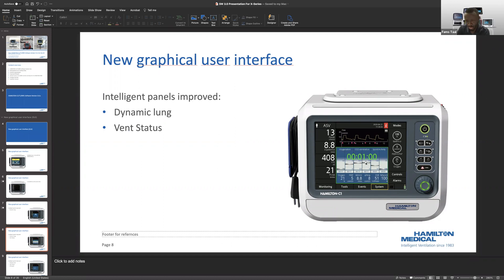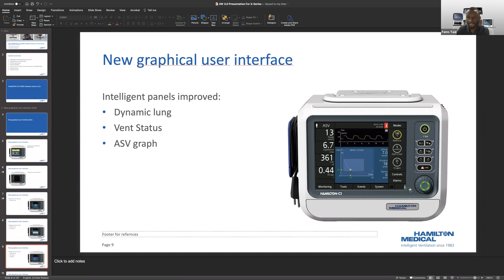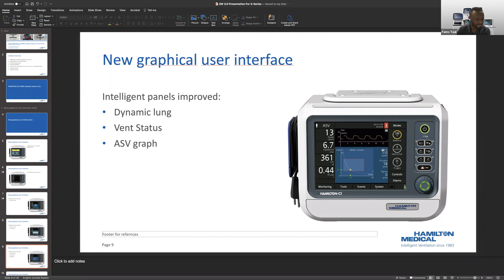I know you guys said transport — I don't know how much you use this, but this is the vent status screen. This is more for weaning; not a whole lot of change other than the color of that particular screen. Same thing with ASV — the ASV graph has changed slightly. The main change is your Pinsp — it's the same on the 2.0, but what we've added is a little rectangle representing the delta, indicating it is above PEEP. That's really the only update as far as the ASV screen and this area of the ASV monitor screen are concerned.